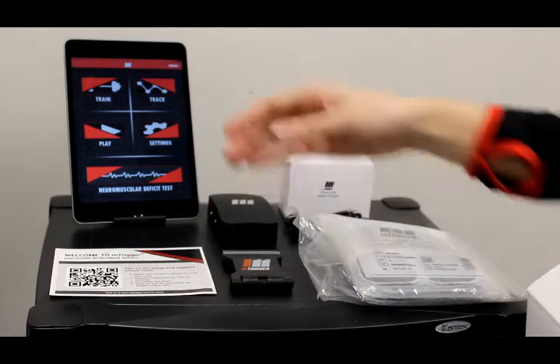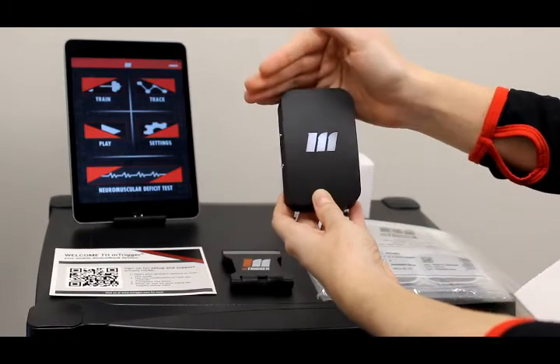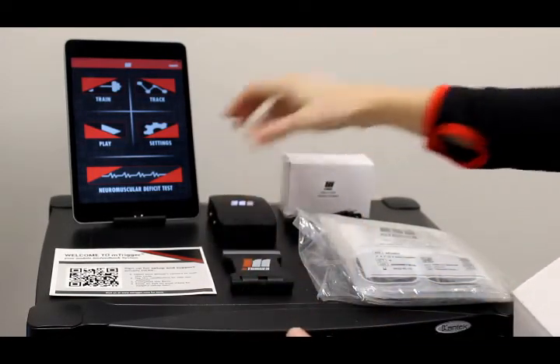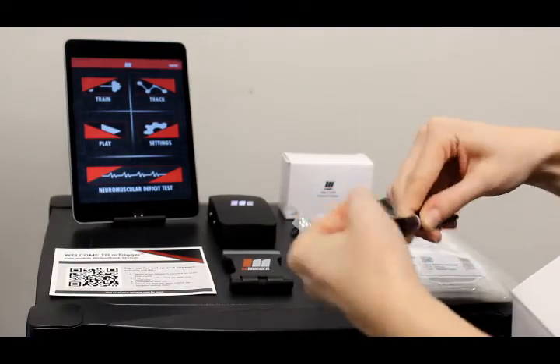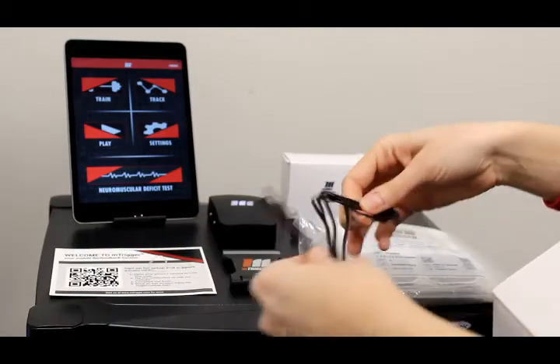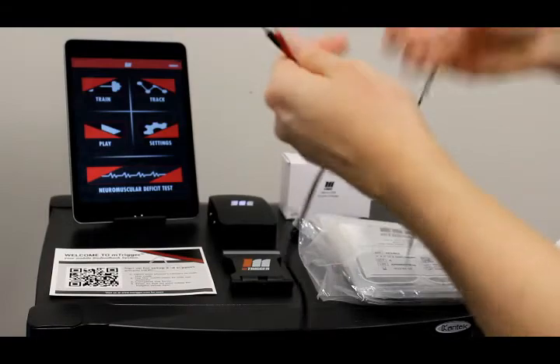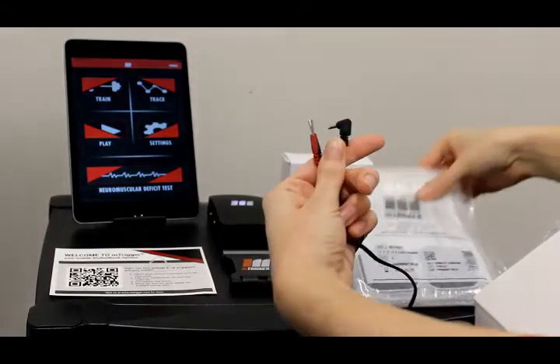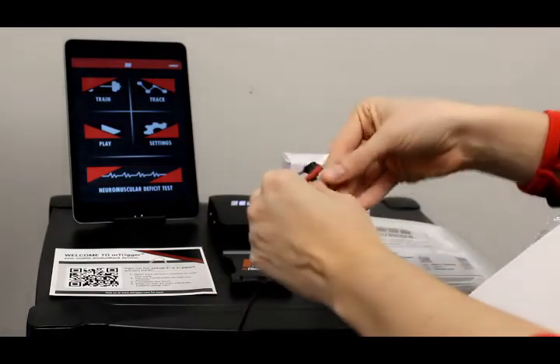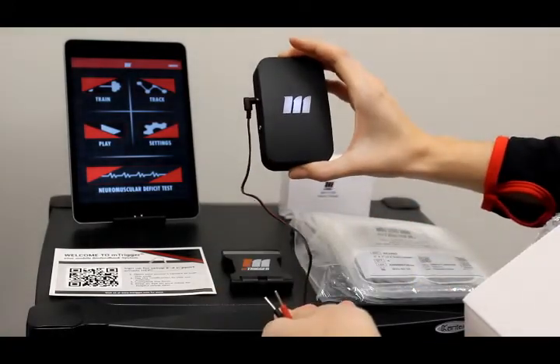We're going to power your mTrigger on by sliding into the down position, and the M should illuminate white. You're going to unravel your cables — we'll start with just one. Open up a fresh pouch of electrodes and plug them into this end. Then you'll plug this end of the cable into the unit, and you're ready to go.